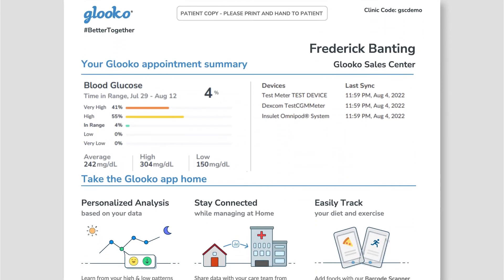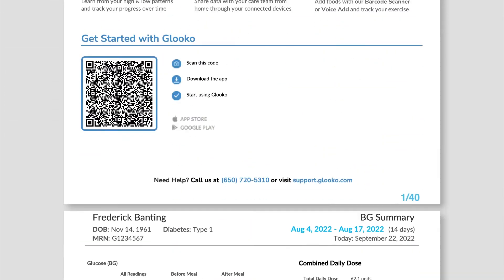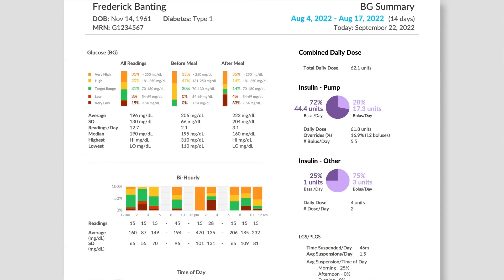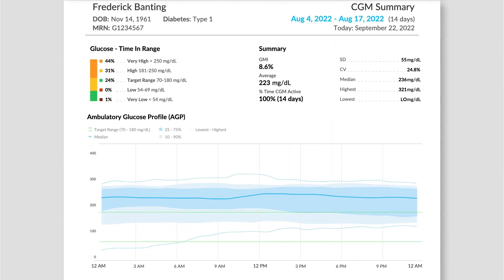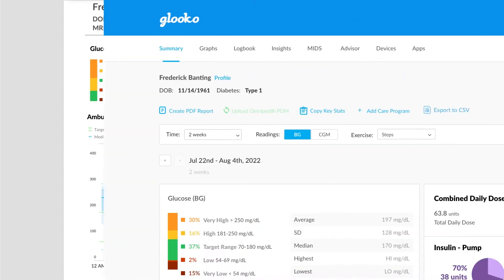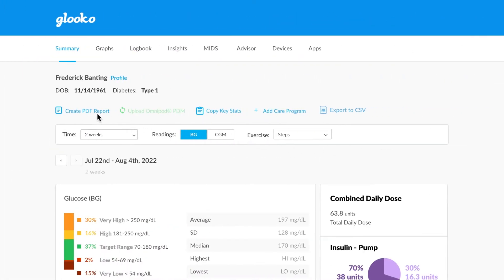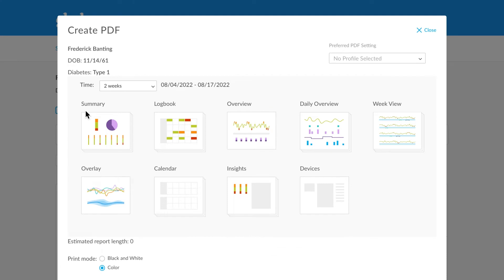Glooko PDF report summaries offer a comprehensive visual snapshot of a patient's data in a single organized space. Leveraging the various charts and graphs available in the Glooko web application, a patient's synced device data is compiled into a customizable PDF report for the provider and patient's review.